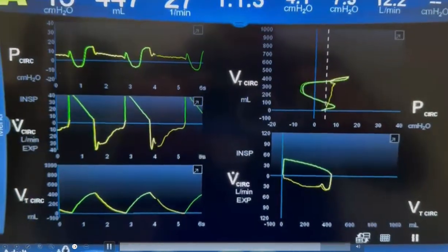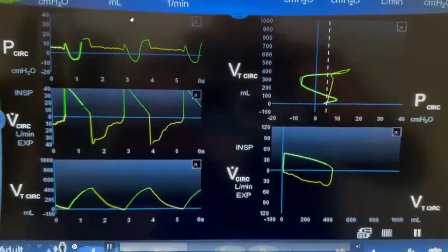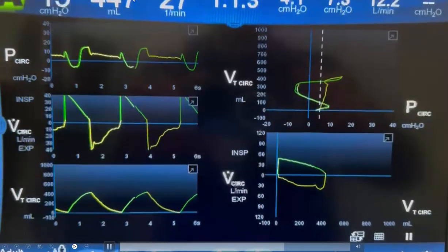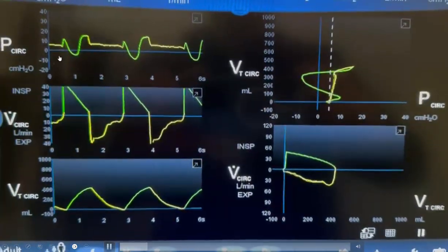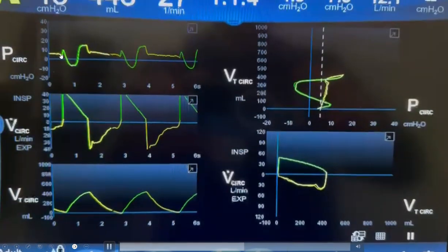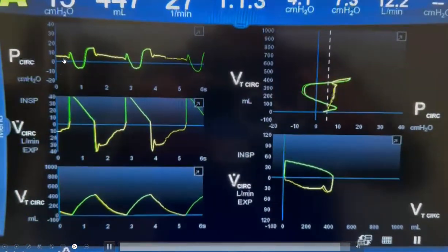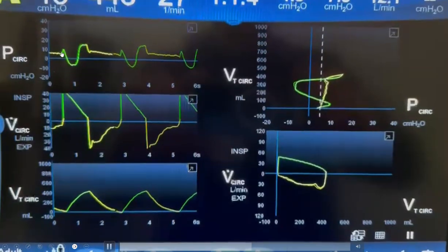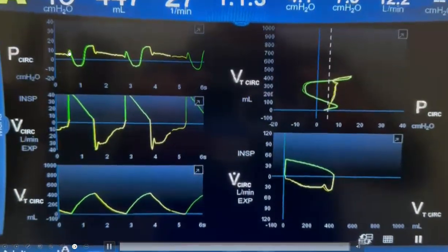The targeted tidal volume was 450. This is the start of inspiration. You can see slight negative deflection. The machine is triggered once, and the pressure goes up to around 10 centimeters of water.